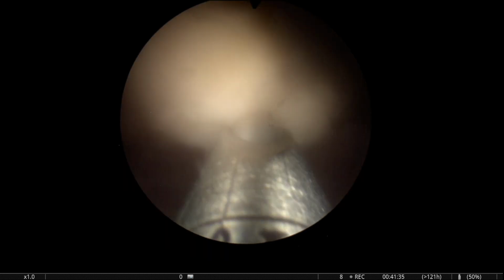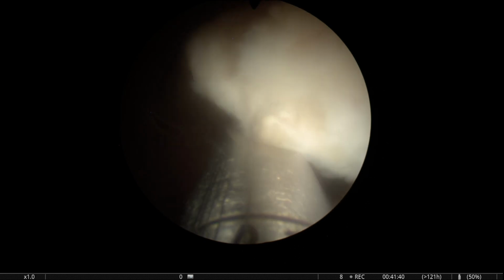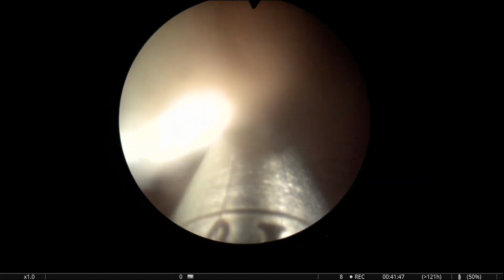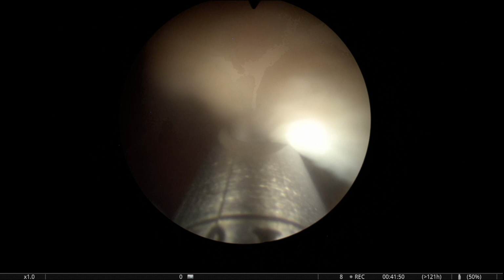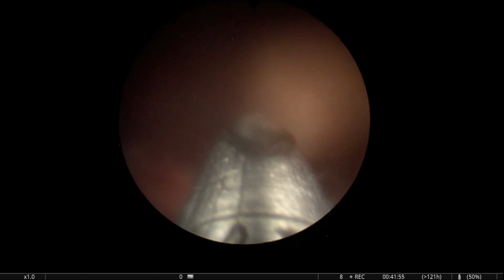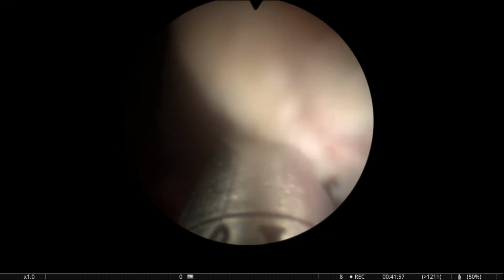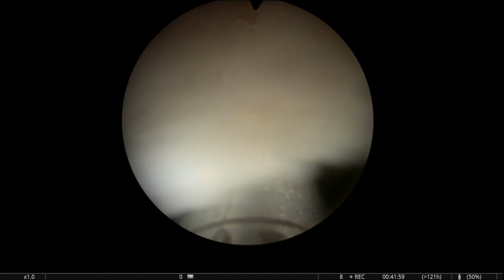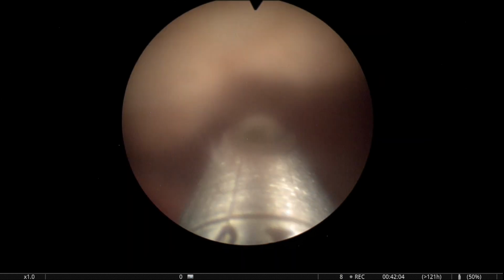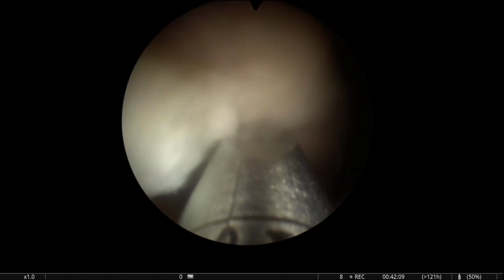So yeah, I think it's always a learning process. I have to say that I still learn a lot, every week. Now, I think this technique, the Bloc technique with early apical release and the preservation of the apical mucosa, is now very well developed. It's quite mature. We could change or modify some of the steps, but not this apical dissection so much.